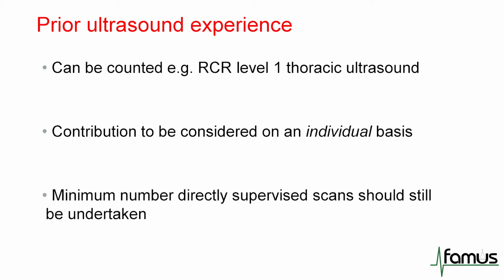Regardless of your previous experience, we recommend that you undertake the minimum number of directly supervised scans, because this will mean that you and your supervisor or mentor will be able to ensure that you understand exactly what the FAMUS accreditation process involves.